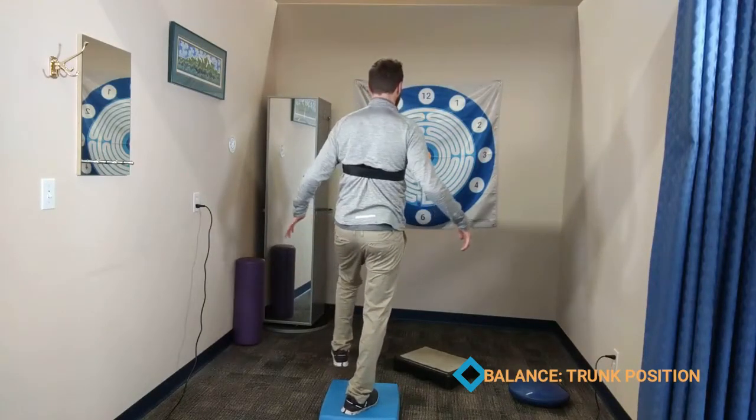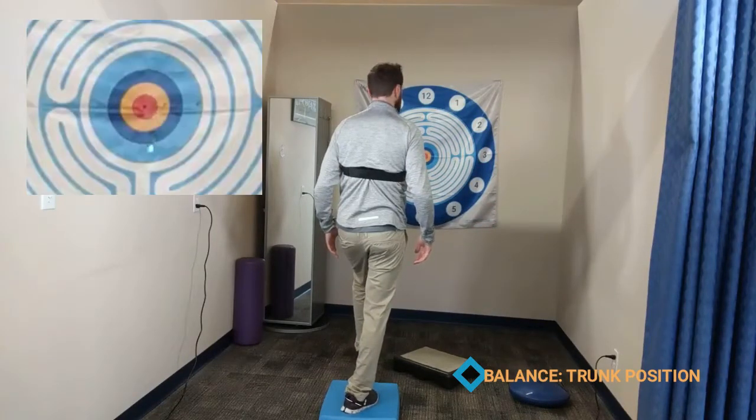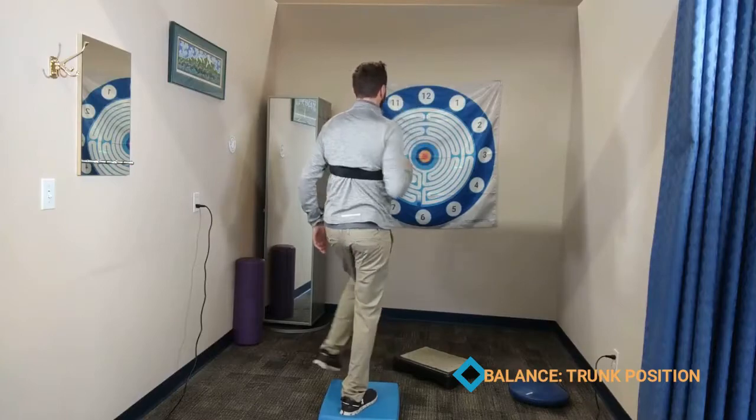Let's take a look at that. You can make these more dynamic by having them aim their head at different numbers, reach towards different numbers, and you can call out the numbers for your client to interact with during the exercise drill.